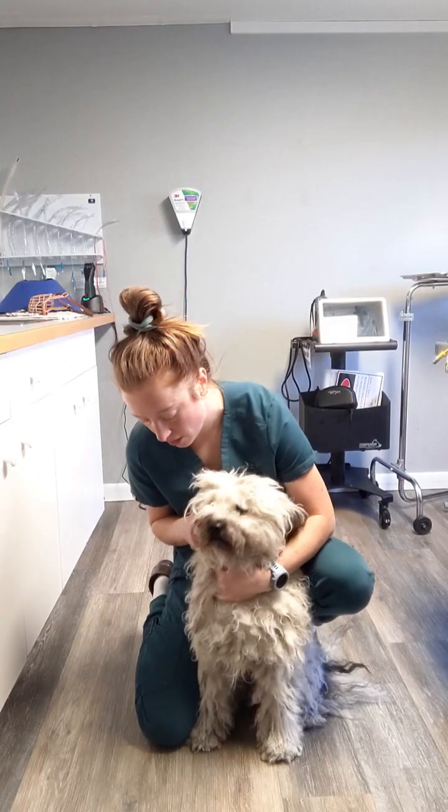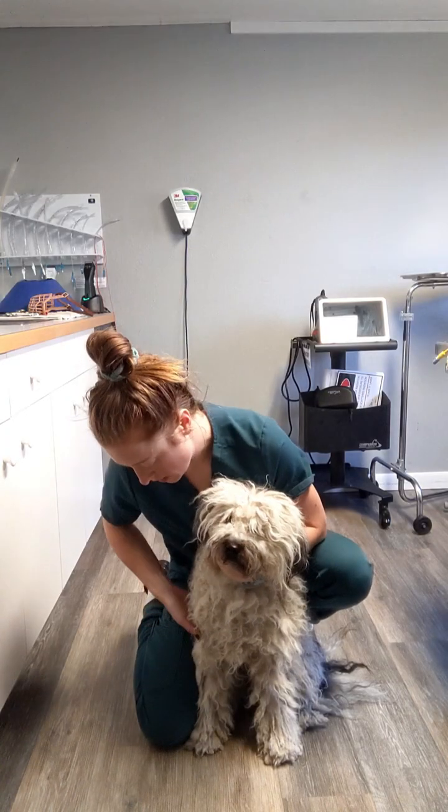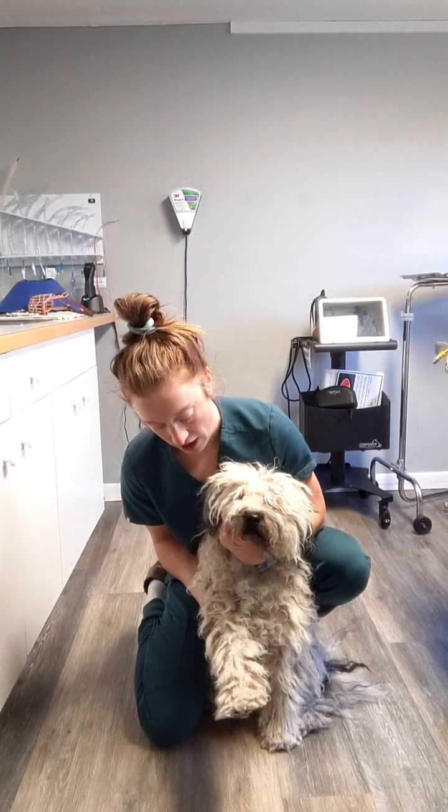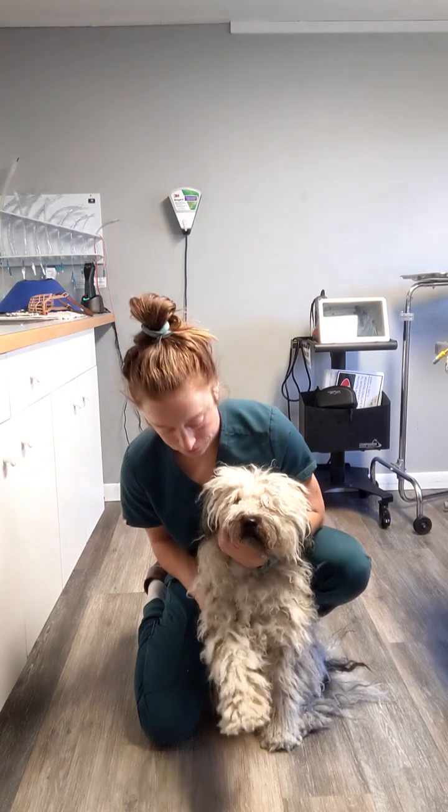For the cephalic blood draw, similar position. I'm usually securing her chest kind of against my body and making sure that I'm also securing the head so that they can't turn the head in any direction. So I'm kind of wrapping my arm around in kind of a C shape, and then I'll lift whichever leg is needed and twist with my thumb and hold that leg out for a cephalic blood draw.